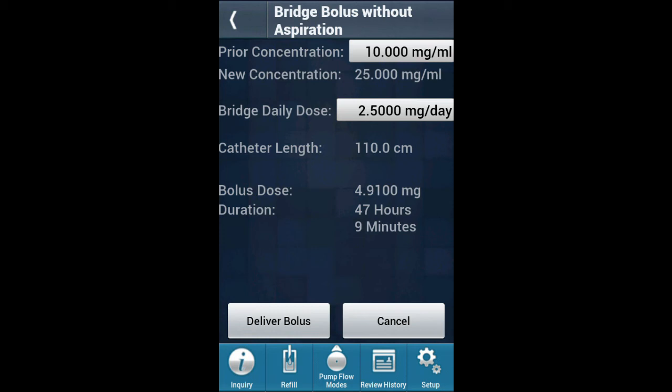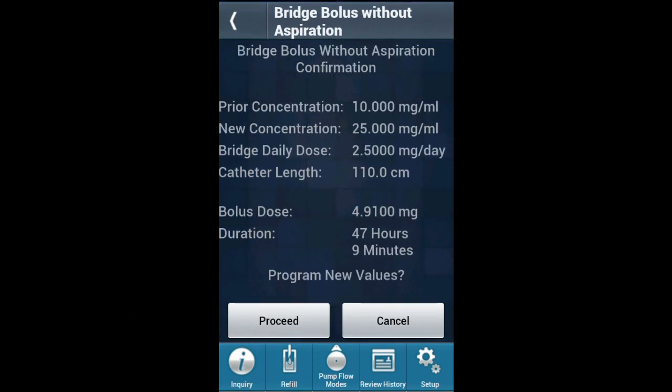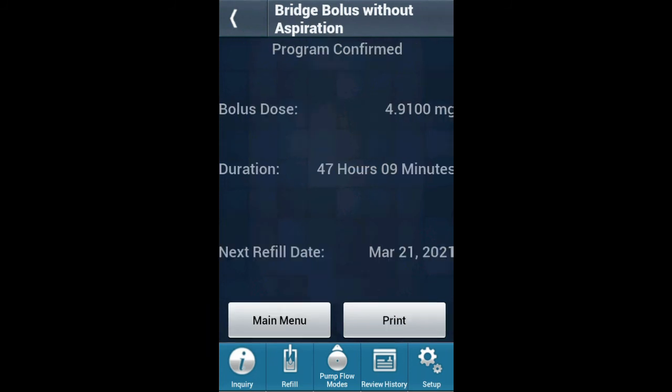After these values are confirmed, click Deliver Bolus. A confirmation screen will appear — please confirm all values and proceed. After the bolus has been successfully programmed, a Program Confirmed screen will appear displaying the bolus dose, bolus duration, and next refill date.